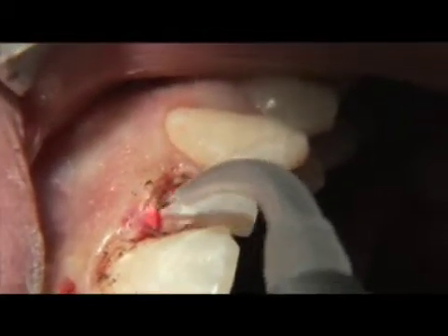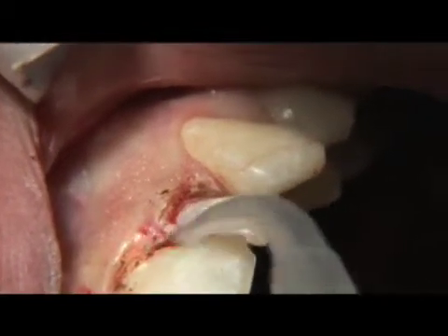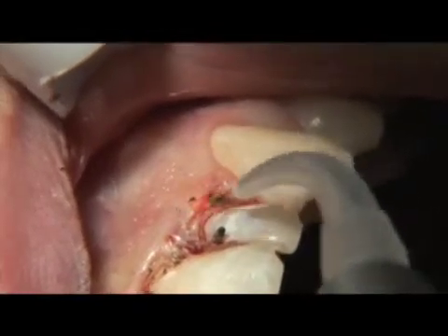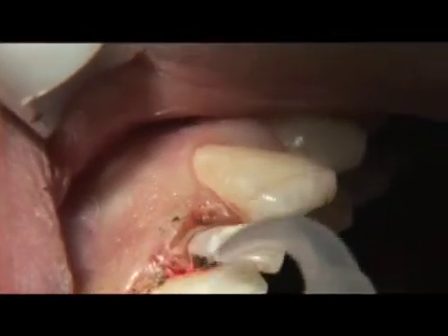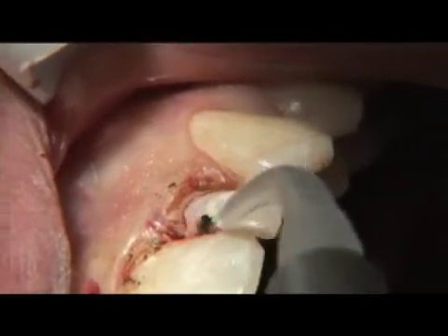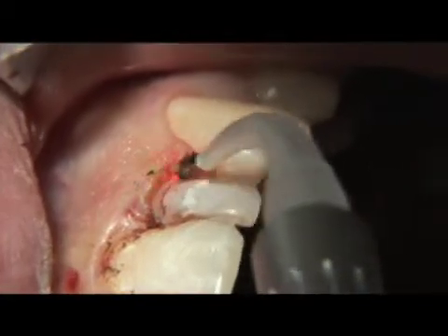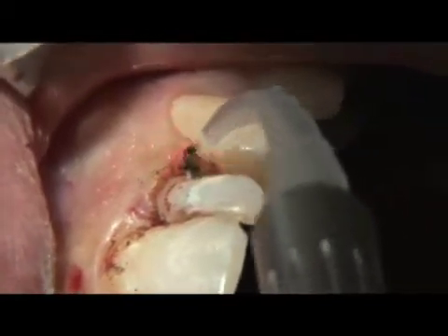Be sure and take your time — there's no rush. Always be sure there is a clear visual field. And because there is no collateral damage using the laser, as with the electrosurge, you are able to go back and forth over the same surgical area without fear of damaging the underlying tissues.